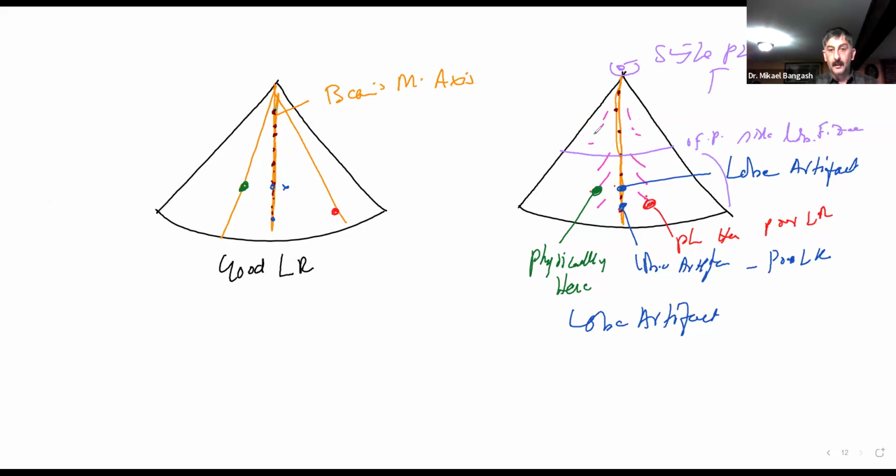We could have a structure here, in this plane here. Lobes that were produced all over are what we call grating lobes. But the system has mechanisms to minimize the production of lobes. So lobe artifacts degrade your lateral resolution. Did that make sense? Good.